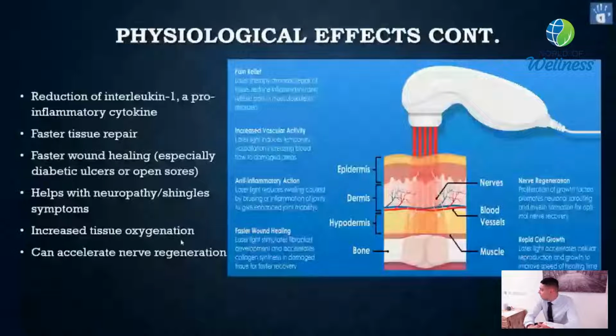Phil, any other things we use the laser therapy for? We use it for your forearm, correct? My calves. Oh yeah, that downhill thing. So we used it two different times on Phil. We used it for his calf muscle. Phil was having tightness in both calves.